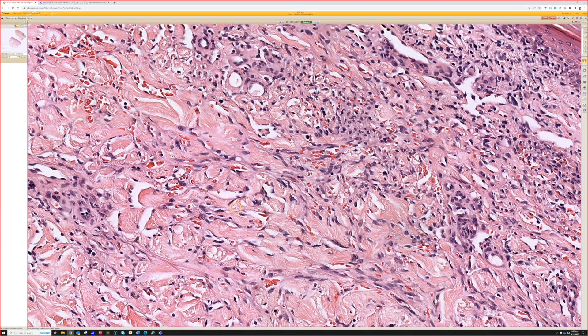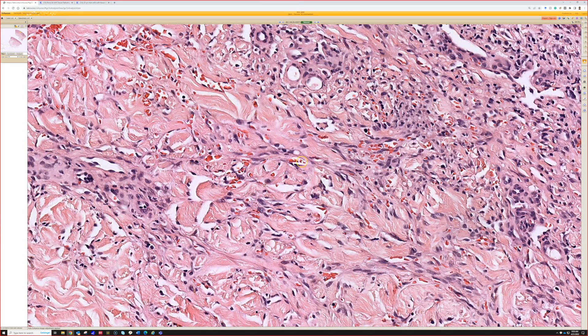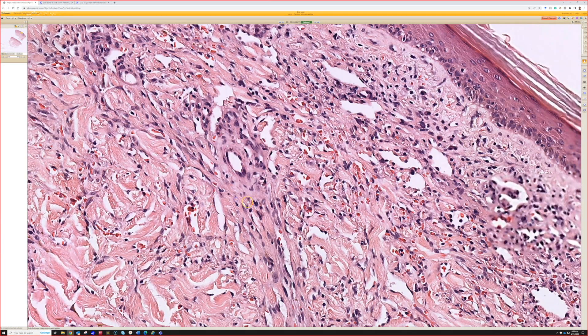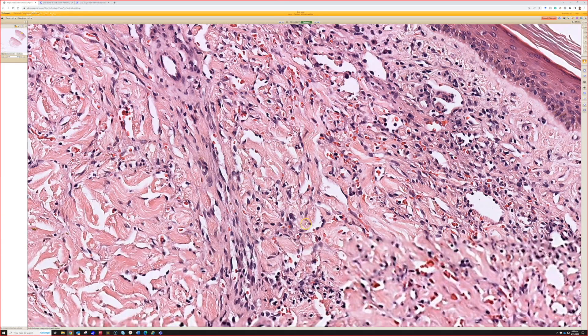On higher power, you can really see that there's actually a lot of slit-like vessels containing erythrocytes — so not really the morphology of angiosarcoma, but you'd keep that on the differential. But this would be good for Kaposi's.